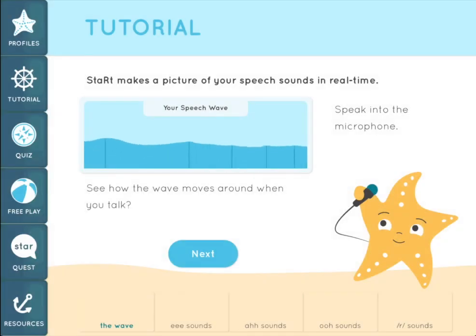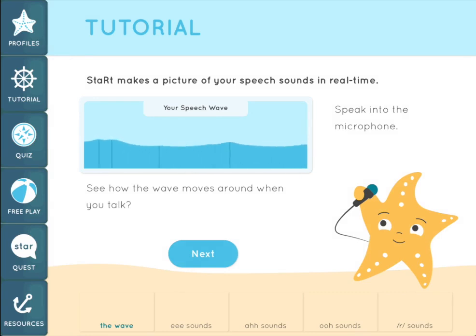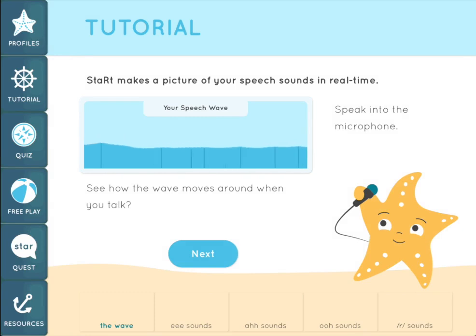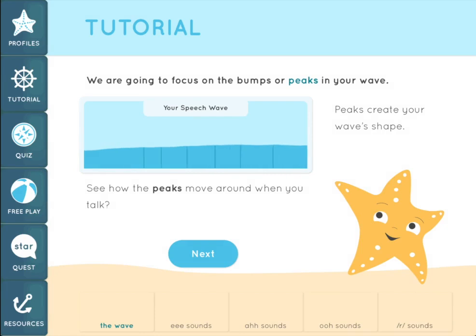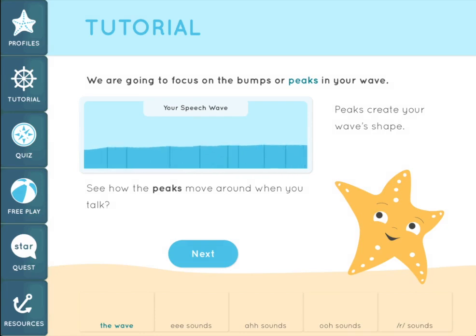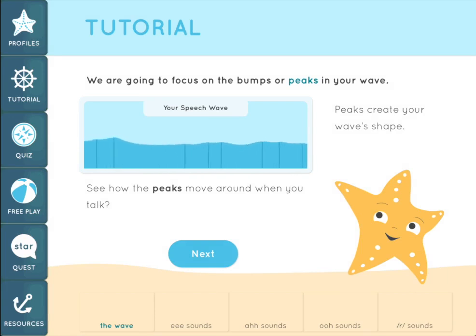START makes a picture of your speech sounds in real time. Your speech looks like a wave on the screen. Right now as I'm speaking into the microphone, see how the waves move around while I talk? We're going to focus on the bumps, or the peaks, along the wave. You can see the peaks moving around and changing the shape of the wave as I am speaking.